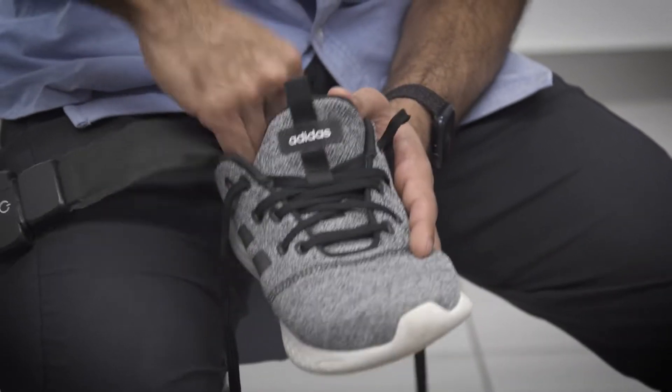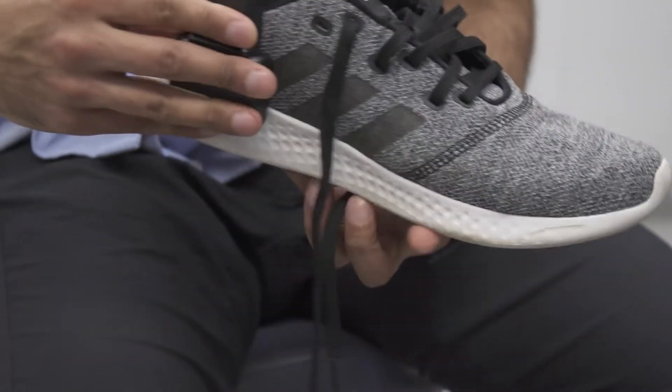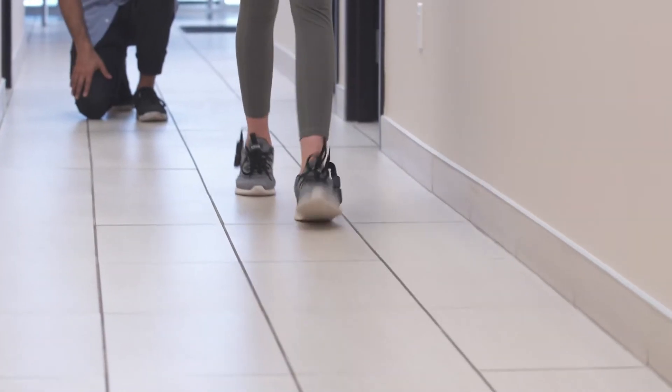The sensors are fast to set up and provide high-quality plantar pressure data that allow clinicians to confidently zero in on pressure and load concerns in a matter of minutes.